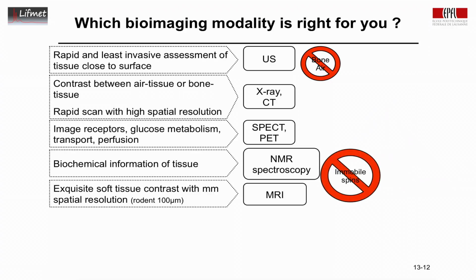The limitation for MRI is that immobile spins, although they carry a magnetization, once it's excited, the transverse relaxation, be it T2 or T2 star, is so fast that for practical reasons it's very difficult, if not impossible, to reliably image. Some specialized acquisitions occur, but as a general rule of thumb, it is not observable. So membranes, cell membranes, don't produce a measurable signal, although they carry magnetization, and bone typically doesn't.